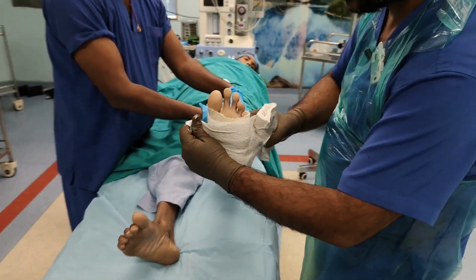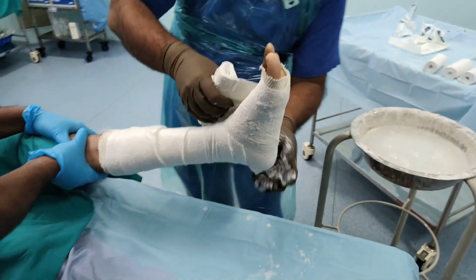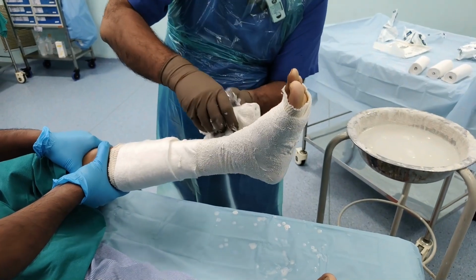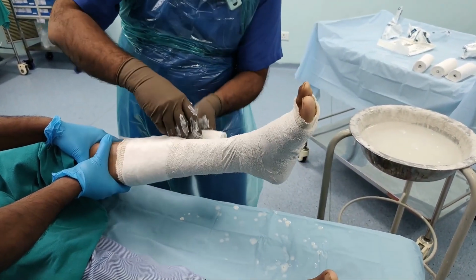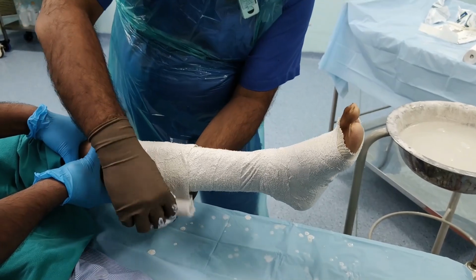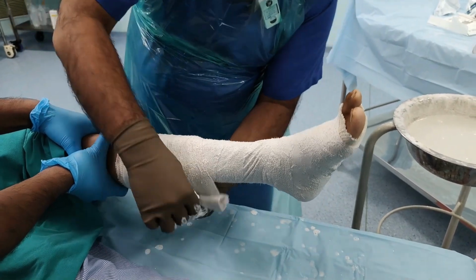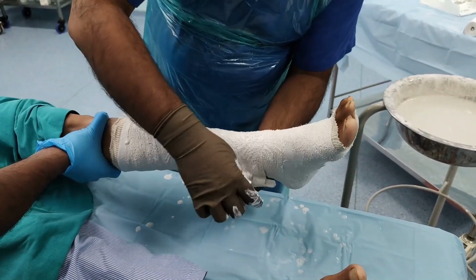Again we start applying from the foot, and in a smooth fashion you have to apply it going proximally, ensuring that you cover 2/3 of the previous wrap while applying the next wrap. You can use your left hand to remove the wrinkles and apply it in a smooth fashion.